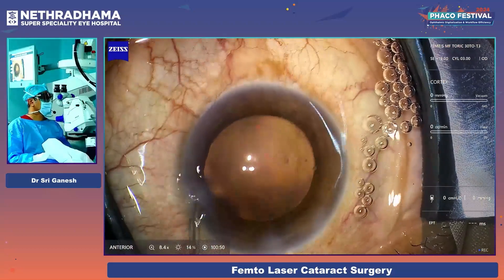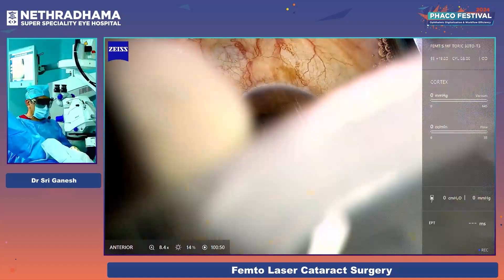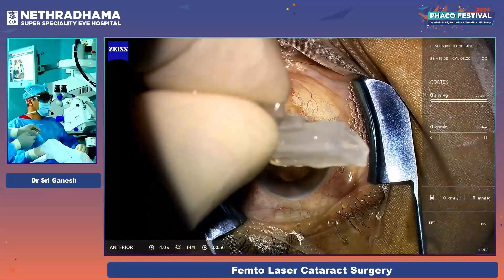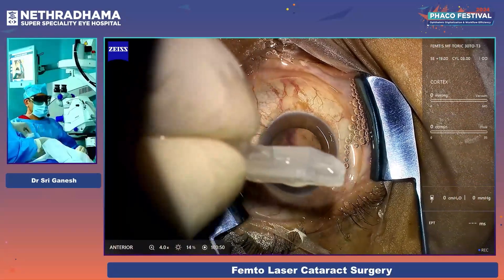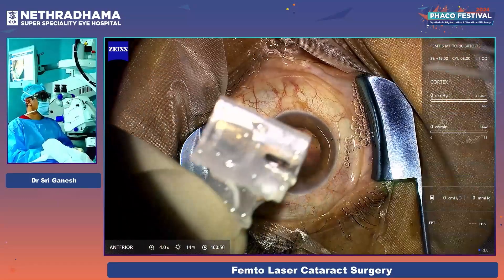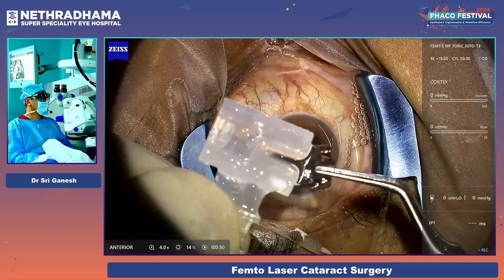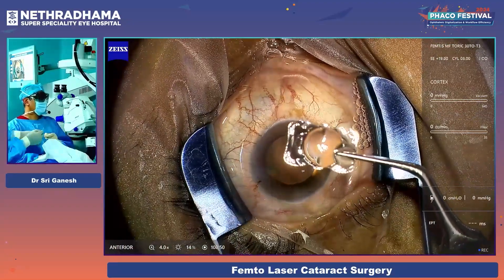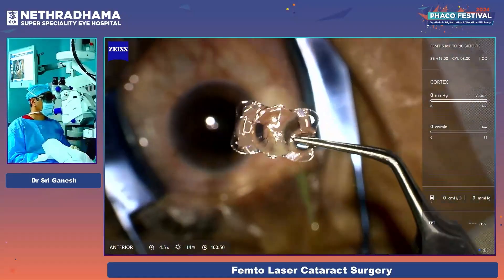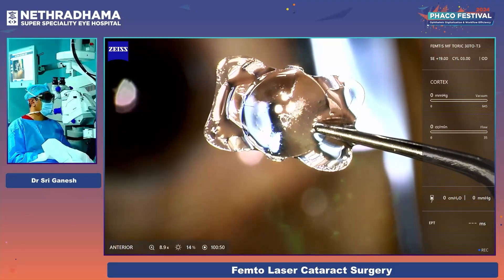Then I am going to do a hydro implantation — I just form the chamber with BSS, and this is the lens now. The lens comes in saline. You pick up the lens and what is very important is the orientation. You can see this is the lens — it is not a diffractive lens.